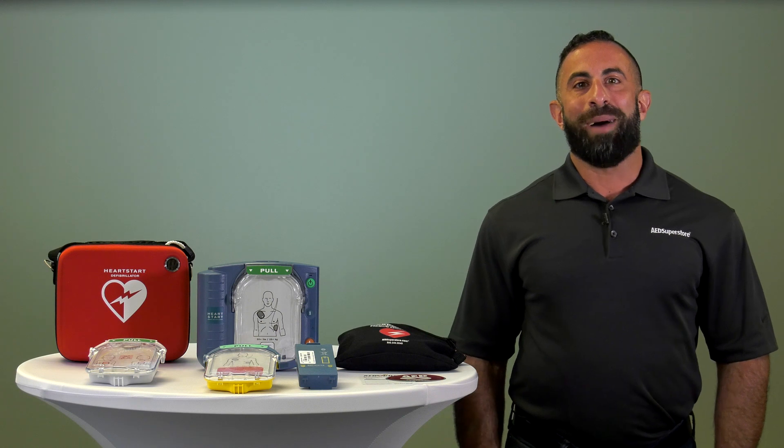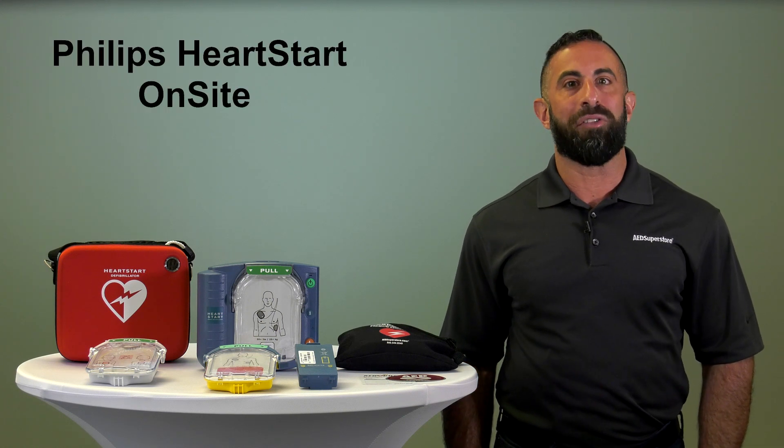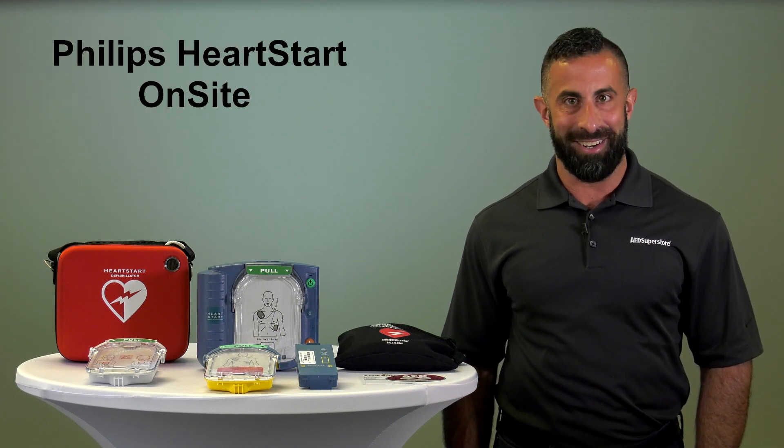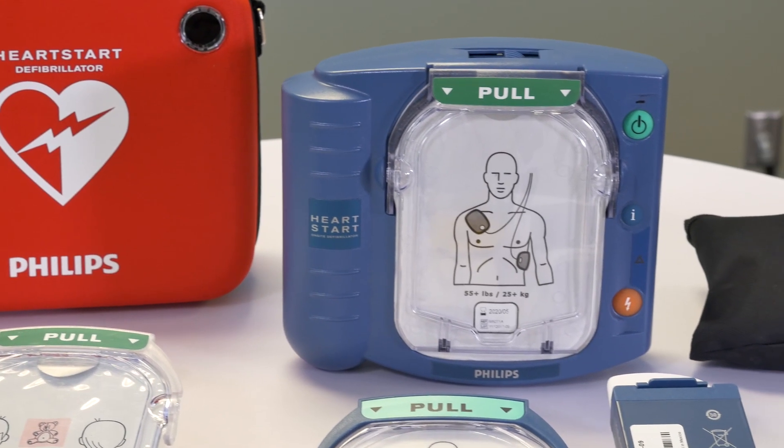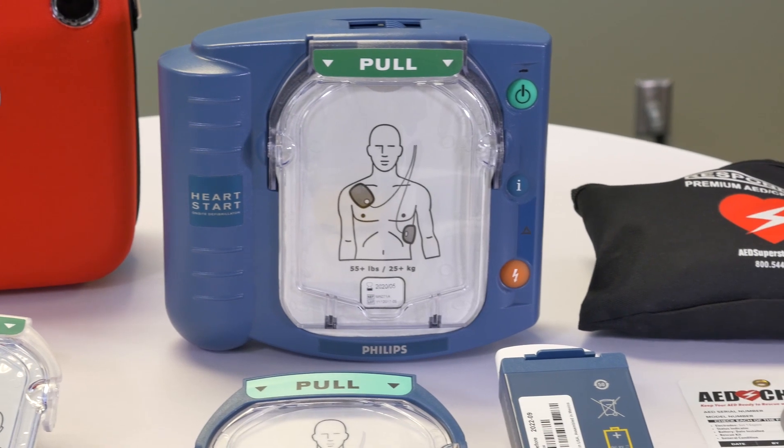Today, we're going to talk about the features and benefits of the Philips HeartStart Onsite. The Philips HeartStart Onsite is designed for the ordinary person, making it extremely simple to use.